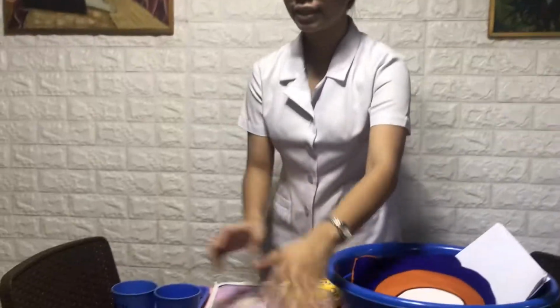So first thing that we need to do is to prepare all the materials that we needed, and then let's do the hand washing. As you can see here, I already prepared the materials that I will be using in this assessment. So first is the kidney basin. Since I don't have that kind of materials here in my end, let's just pretend that this is a kidney basin instead.